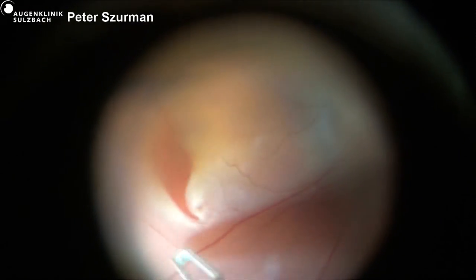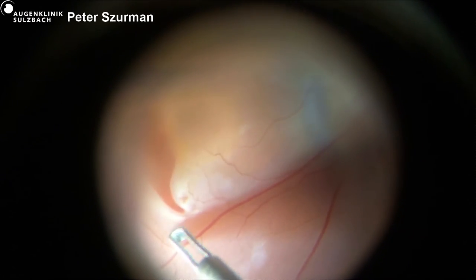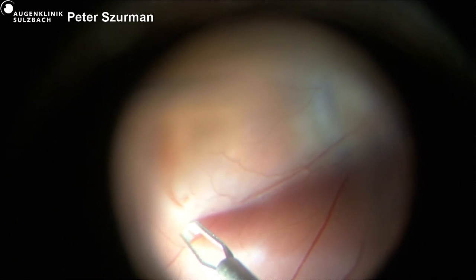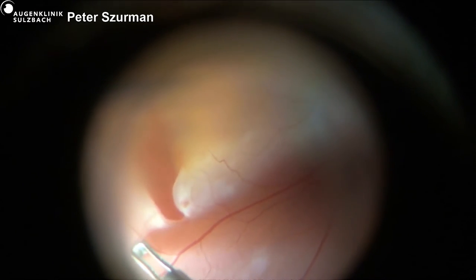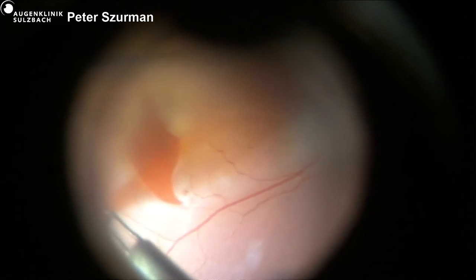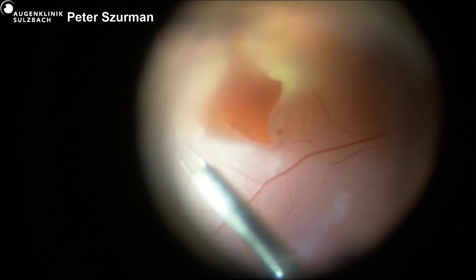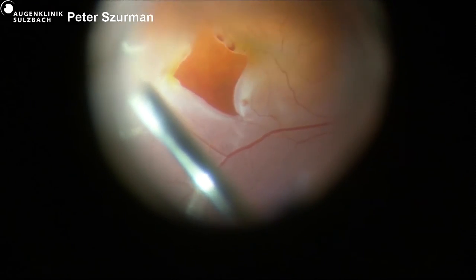But in the optic pit, the mechanism is only to close. So in my experience, the amniotic membrane in optic pit sometimes moves. Yeah, I think so. It's not easy.